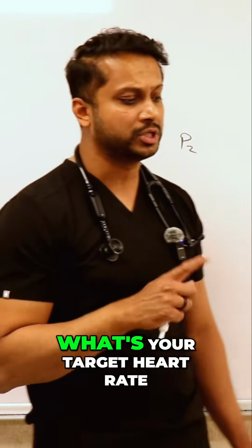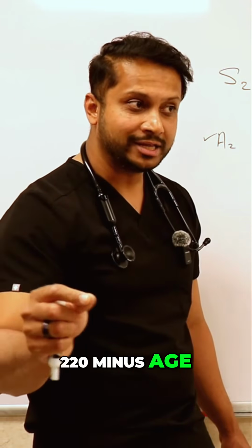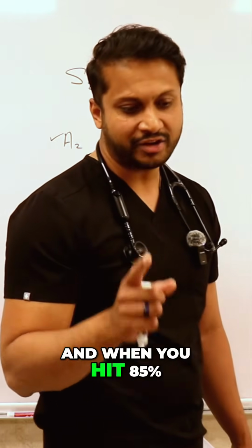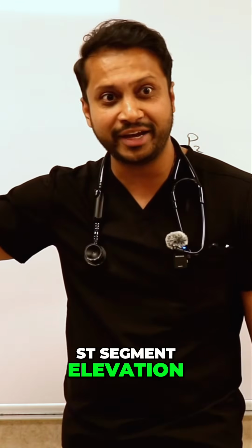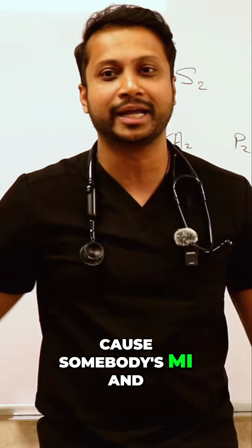Now when you exercise somebody, what's your target heart rate? 220 minus age, and then you want to hit how many percent of that? 85%. And when you hit 85%, what are you looking for on the EKG? ST segment elevation. No, I'm joking. You're not trying to cause somebody's MI and kill somebody here.